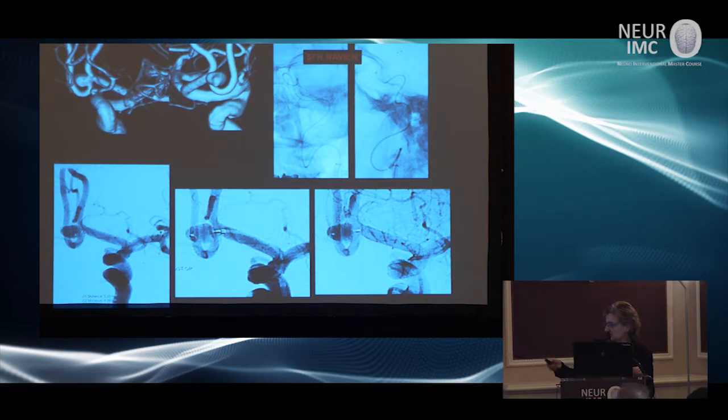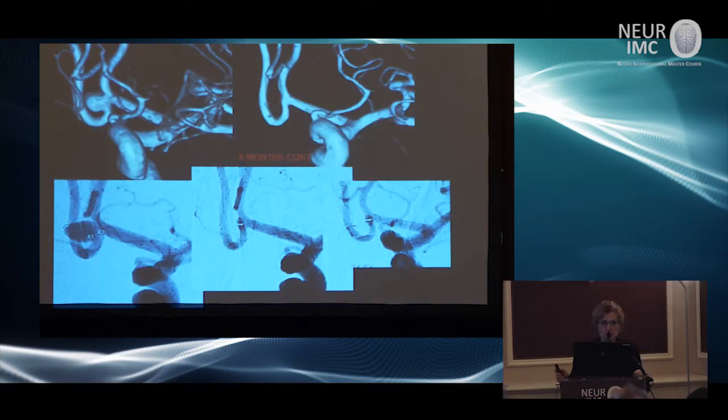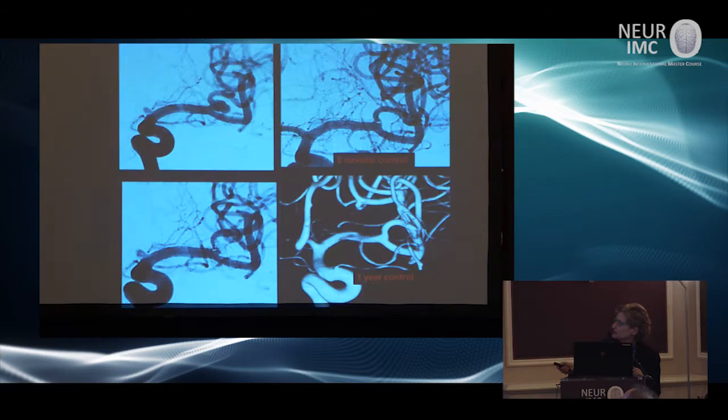One device. The most difficult part, or the part that takes most of the time, is the sizing of the device, because it is the secret of its success, or of you getting into trouble. So you have to take your time to do the sizing. It is the most important part. 6-month control on the same patient.